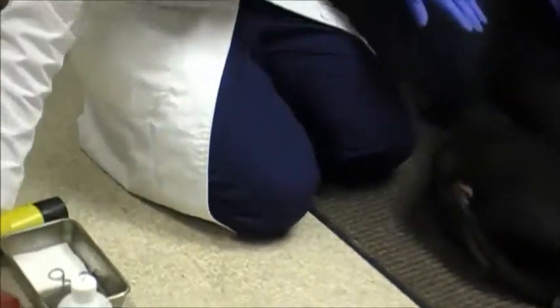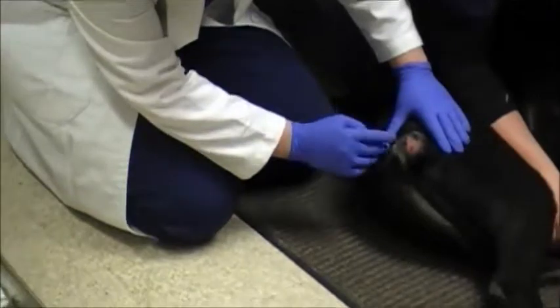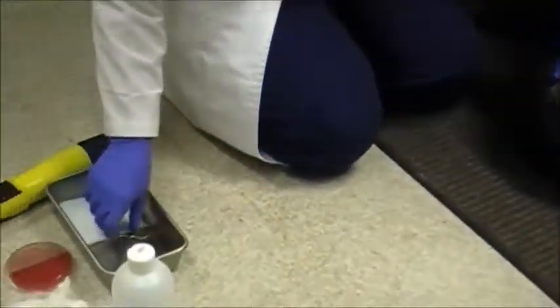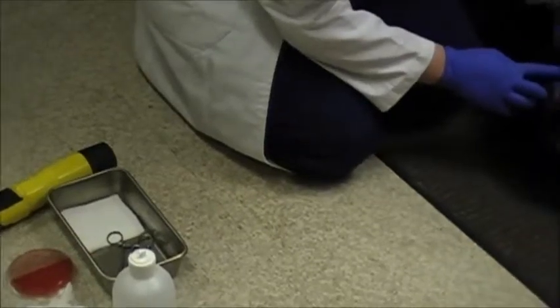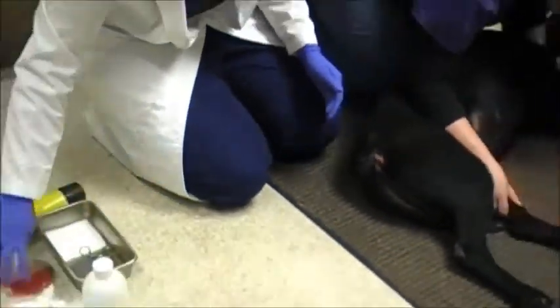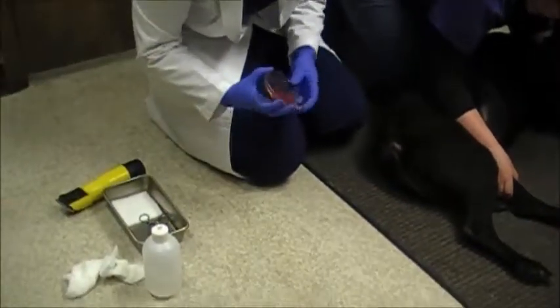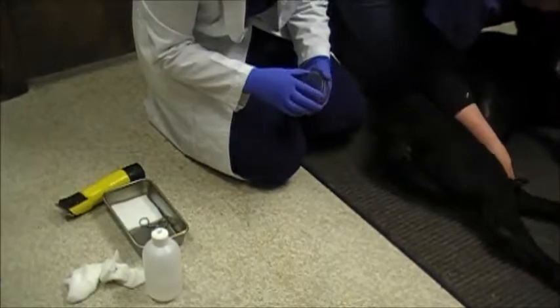Taking my sample, what I want is a little bit of the hair. I've got forceps from the cold tray — sterile. Then I'm going to pull a little bit of the hair out from the peripheral edge of the lesion. And then I'm also going to try and scrape and get some of the skin scales into it also. So I'm going to put it straight into my ringworm test medium, my DTM.